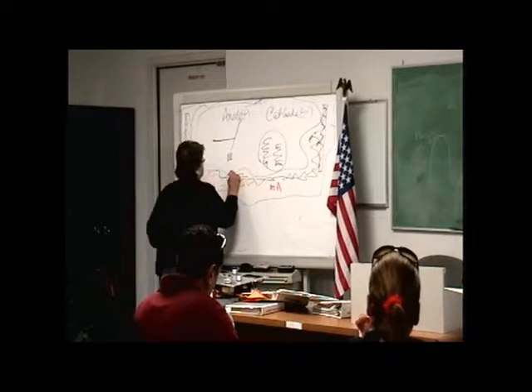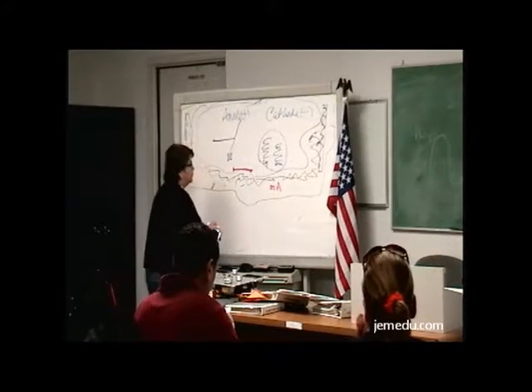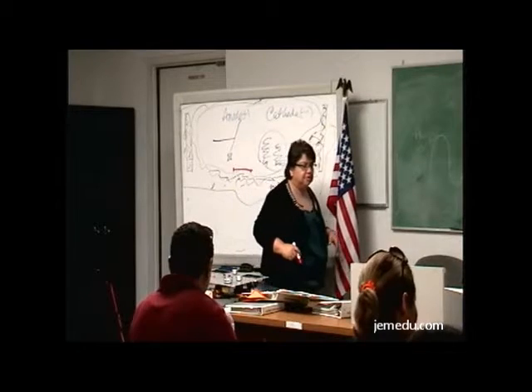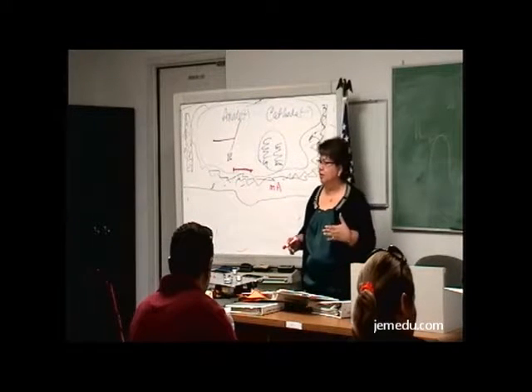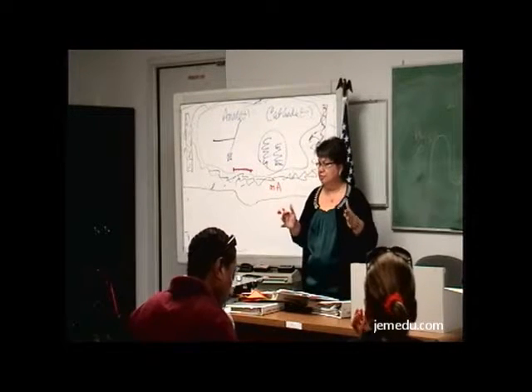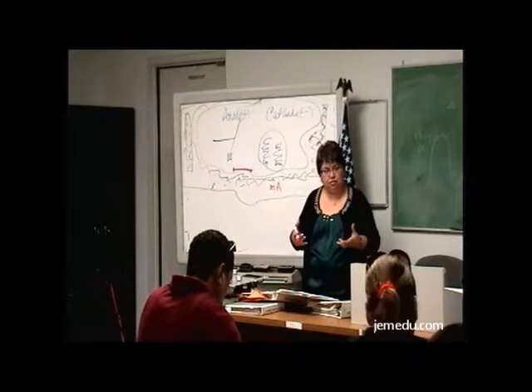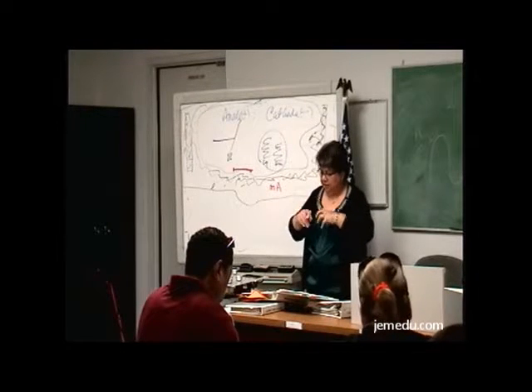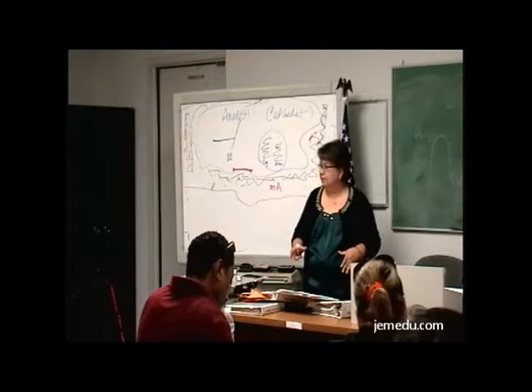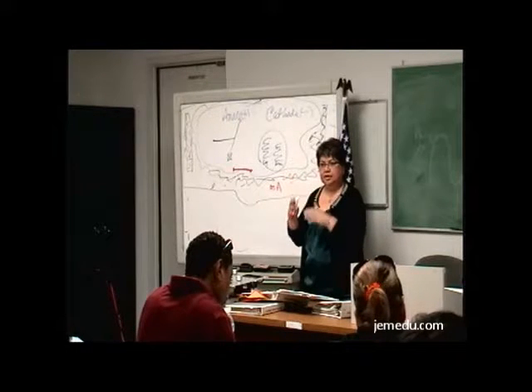Okay, and on the very bottom portion of the glass, we call a window. Now I don't mean it's a window you can open or anything special. It's all made exactly the same. However, it's kind of indicated in that area. This is where the X-rays are going to pass through. So when you look at the glass part of the tube, you could actually find, here's the window, meaning this is the region where the X-rays are coming out. It's not any less Pyrex or anything different. It's just that the glass has been designed to give you an indication of where the X-ray is going to be exiting the tube.